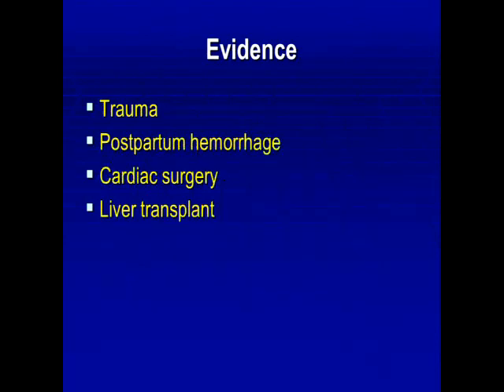So we'll quickly go through some of the evidence for ROTEM. I'm going to focus specifically on trauma and postpartum hemorrhage, but it's just because of time constraints. But just to note, most of the early ROTEM data actually comes from cardiac surgery, and now it's used quite extensively in liver transplant as well, both intra-op and post-op.